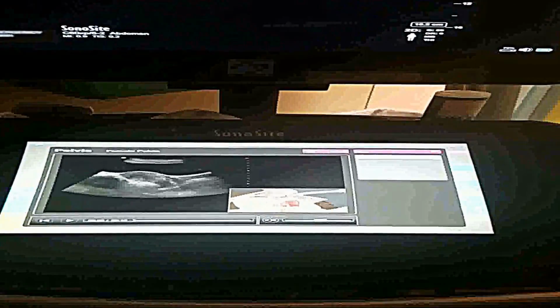And then here we're going to start going into some of the learning. We'll start with the female pelvic ultrasound, and we'll move through some of the more ICU acute care stuff and more into the OBGYN and the musculoskeletal with the anesthesiology at the end. Enjoy the review.